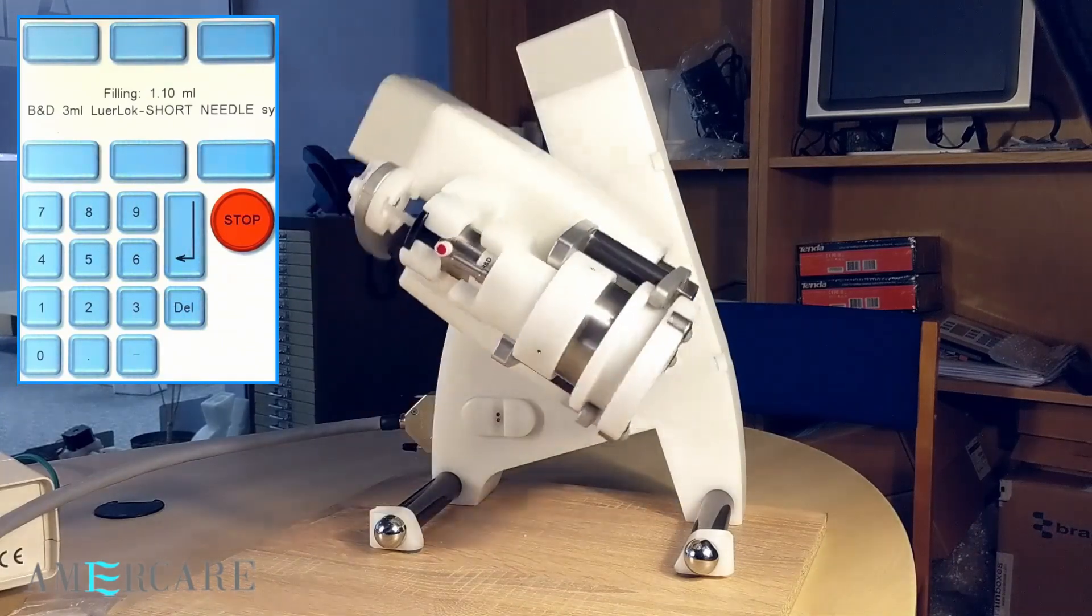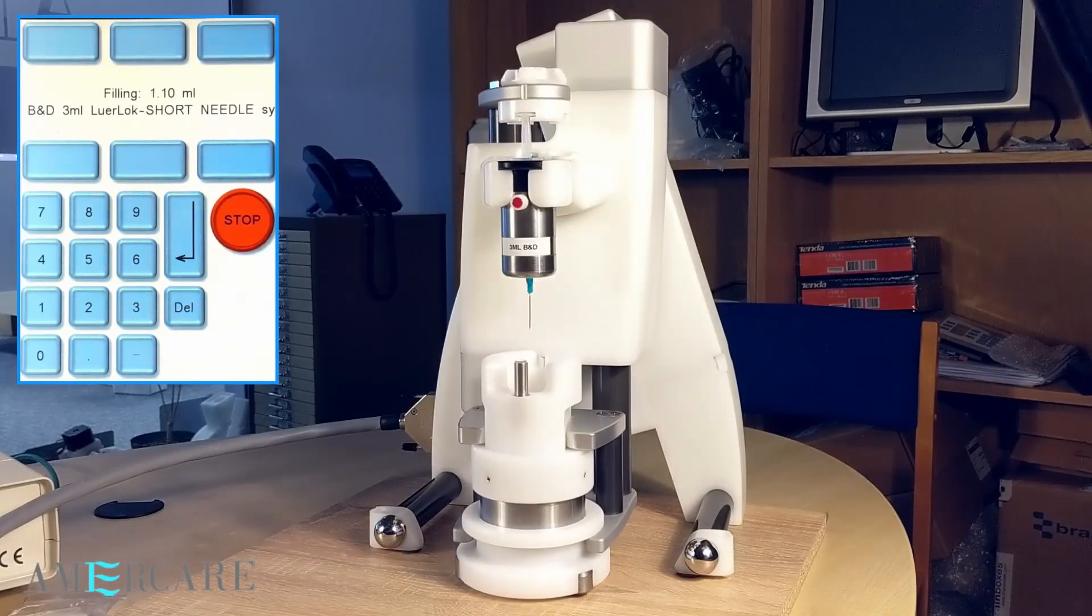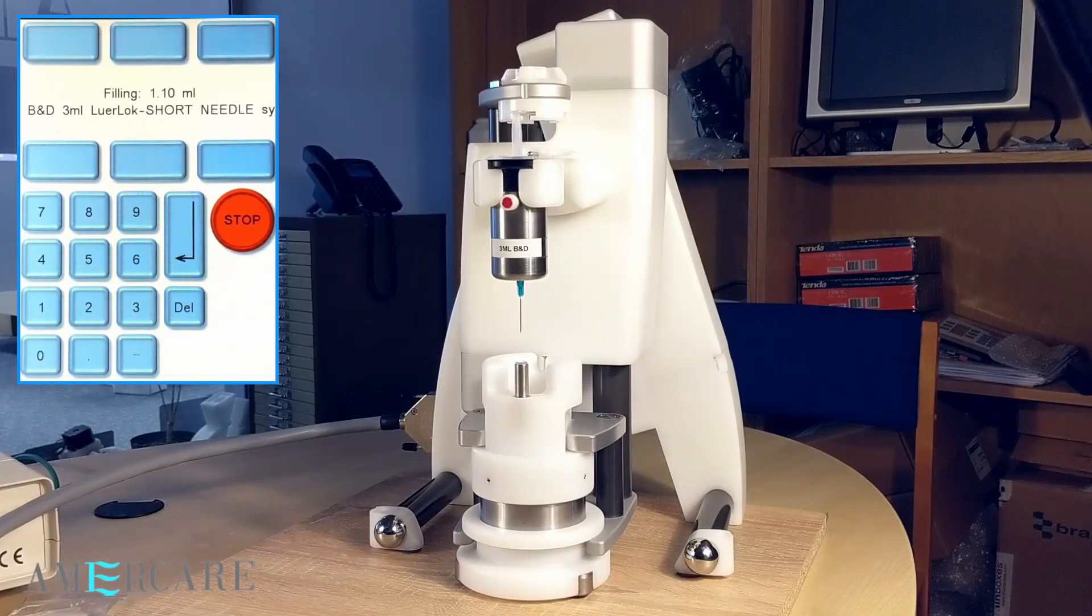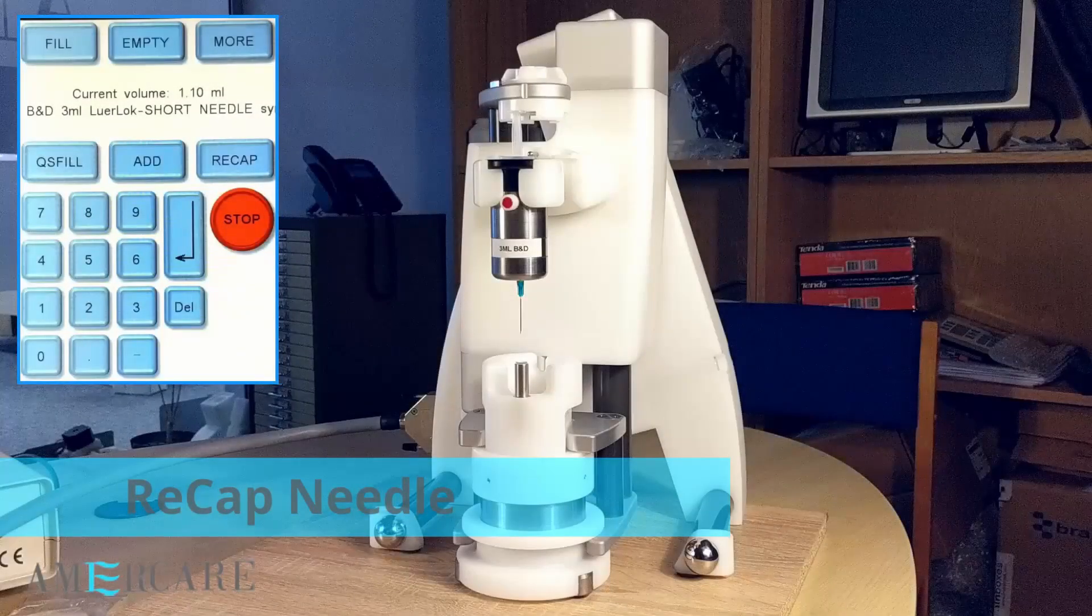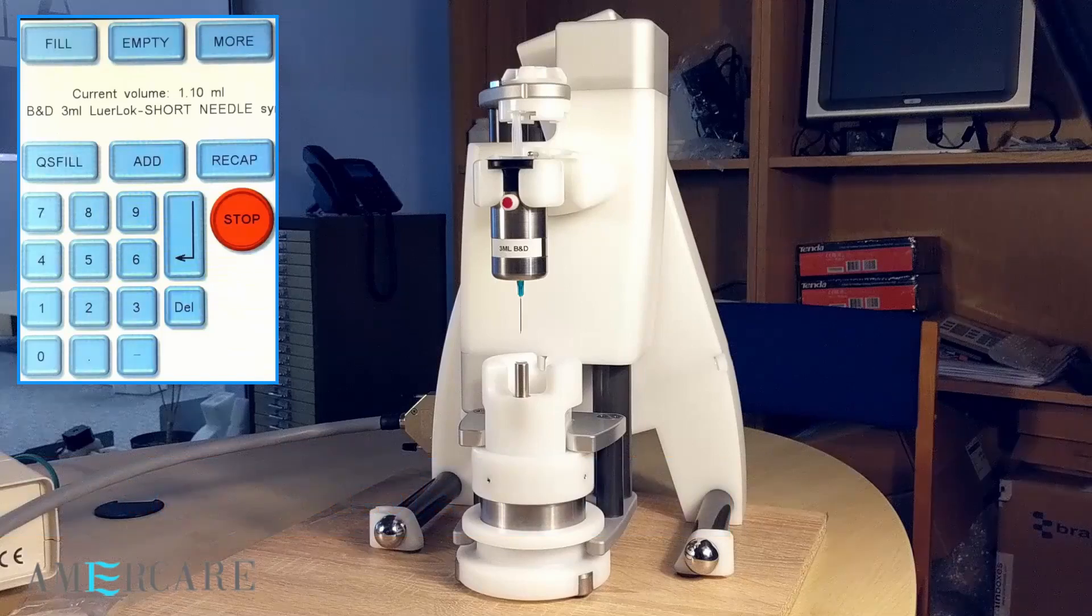The head inverts and moves the syringe to the unload position. Once the fill is complete, the unit can recap the needle sheath.